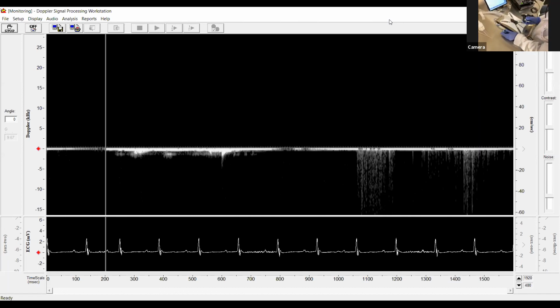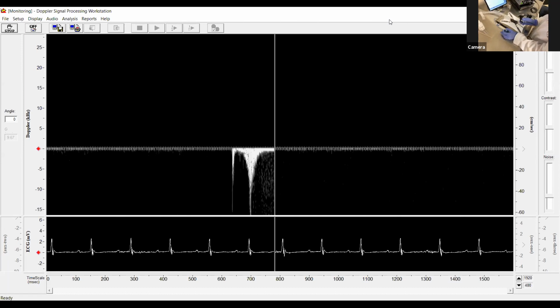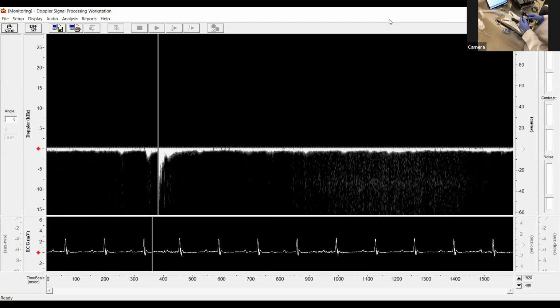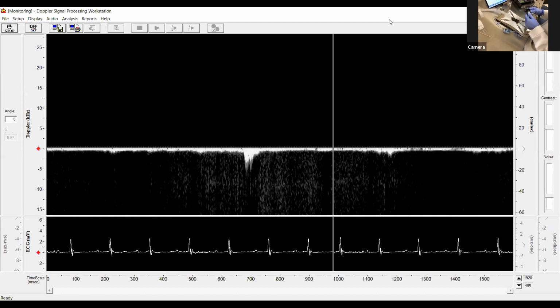The micropositioner has a multi-locking mechanism in which there's a knob that Sydney can turn that tightens each connection sequentially, if you'd like.